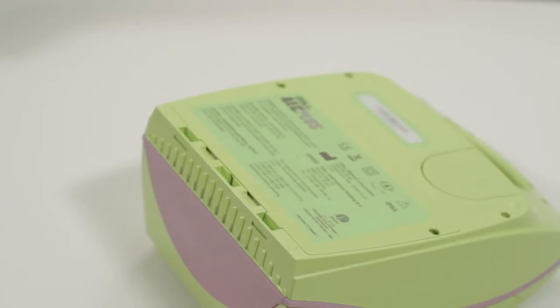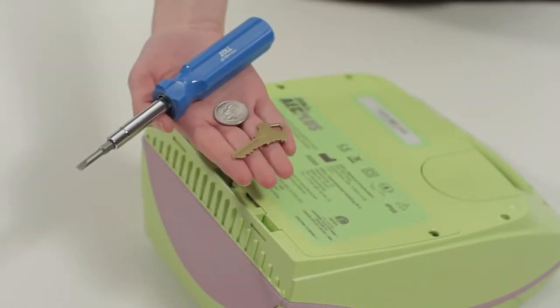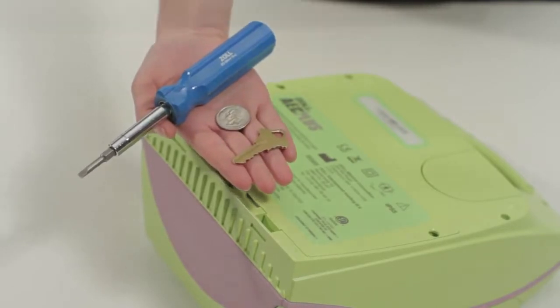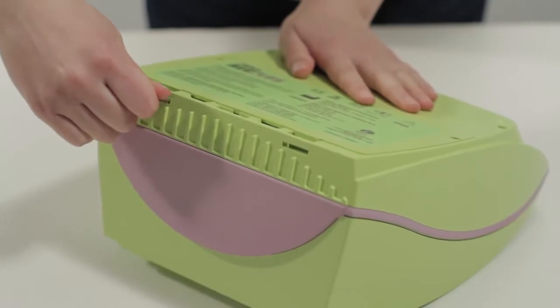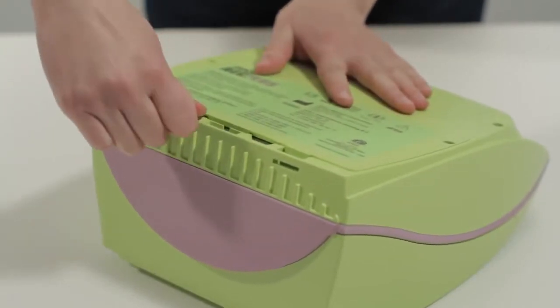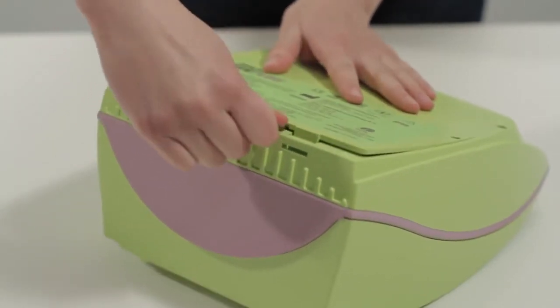Now remove the door to the battery compartment on the bottom of the AED Plus. This requires a simple tool. A large coin will work fine. Push in on the two slots of the battery compartment door. Then use the coin as a lever to lift the door.